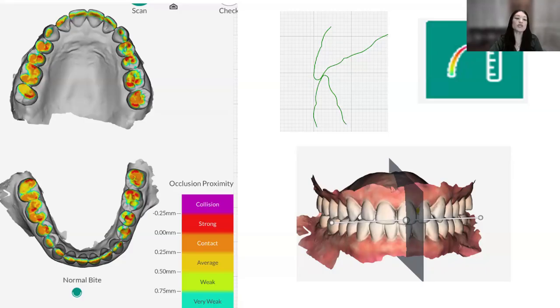It's going to show you where the patient articulates very lightly and where they get a little bit heavier in the articulation, or where they grind or bite heavier on certain areas of the mouth. And it's represented by the colors. We also have the ability to slide left to right to see in real time closely how the anatomy is occlusally and what's happening.